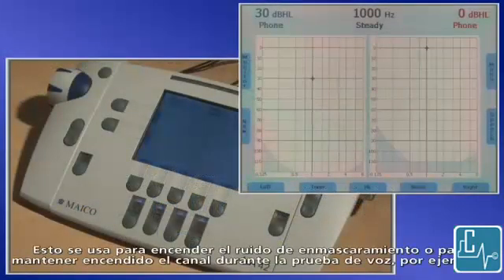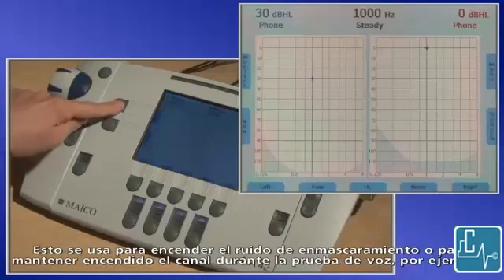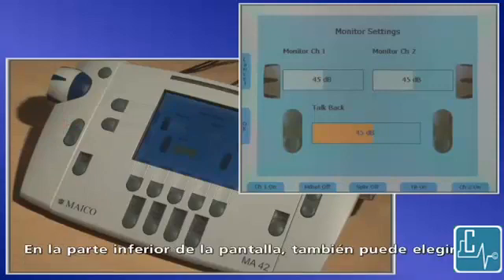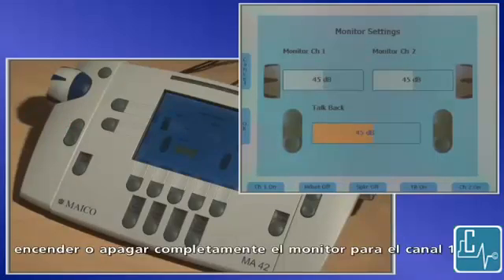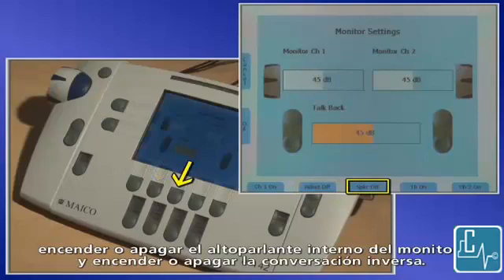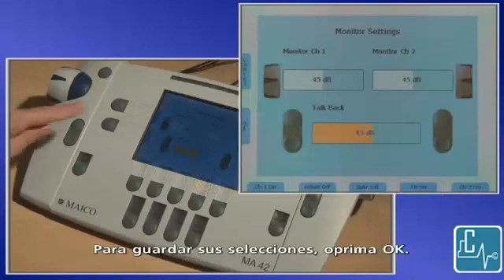While in the tone screen, select the monitor button on the side of the screen. Here you can adjust the level of the monitor of channel 1 and 2 by turning the side dials, and adjust the level of the talkback using the plus or minus keys. At the bottom of the screen, you can also choose to turn monitor for channel 1 or 2 completely on or off, the monitor headset on or off, the internal monitor speaker on or off, and talkback on or off. To save your selections, press OK.